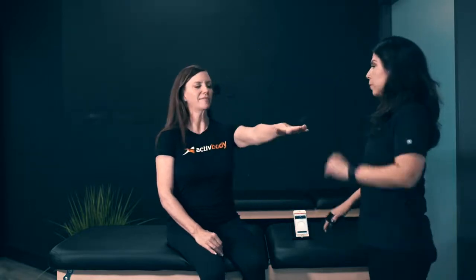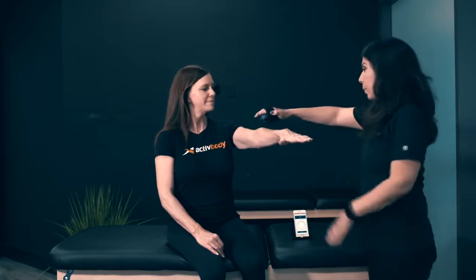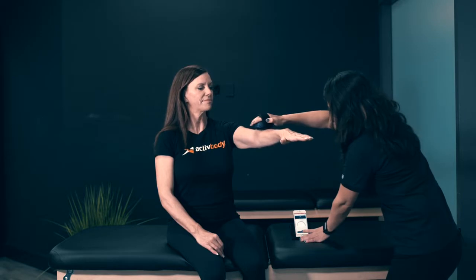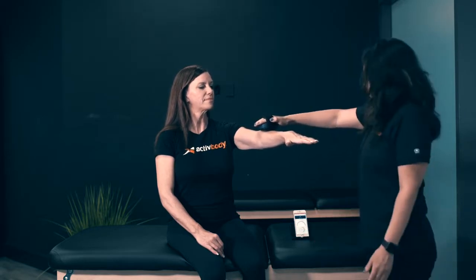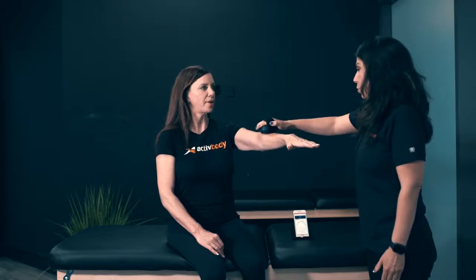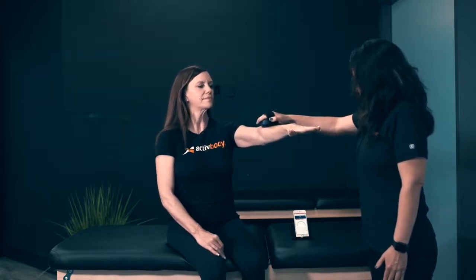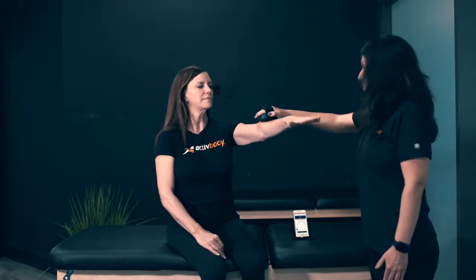We're going to start off with strength. We're going to do your left arm. I'm going to have you hold your arm out in front of you, and with the ActiveForce app on my phone, I'm going to record your strength on this. I'm going to press start. It's going to calibrate for about three seconds, and now I want you to resist as I push down.